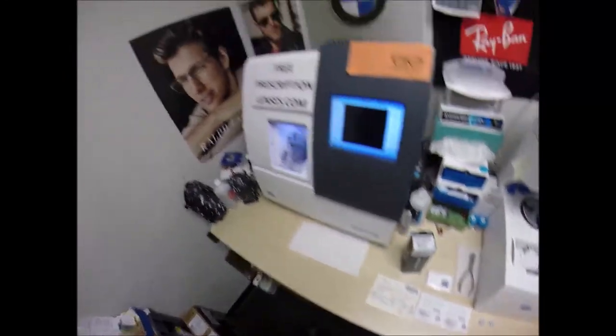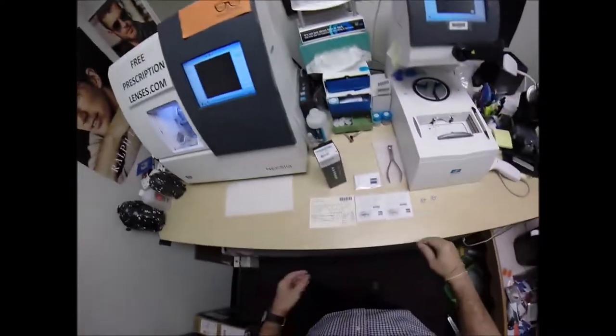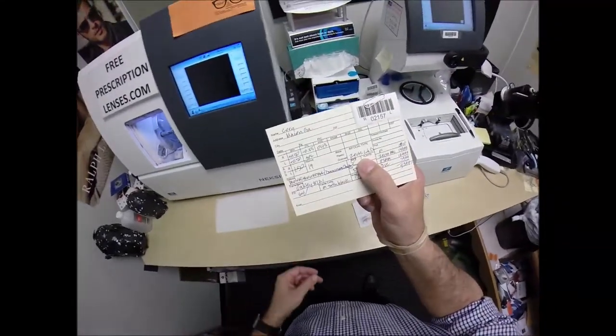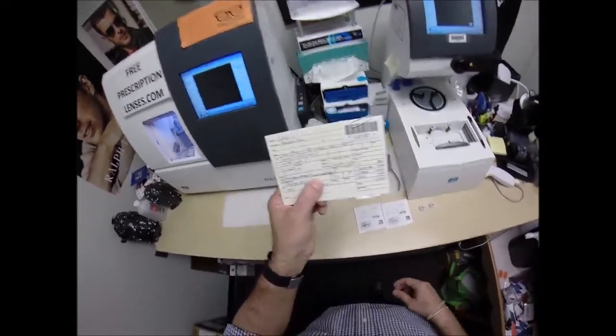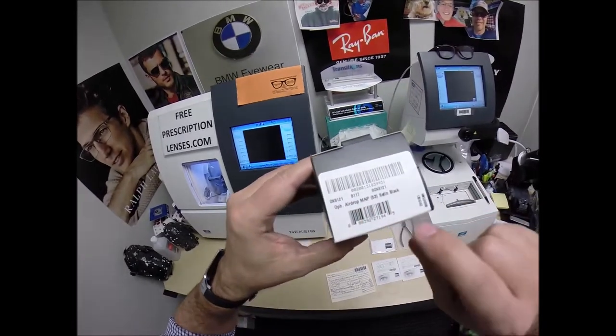Cory in Macon, Georgia. See more better with freeprescriptionlenses.com. Call me Moe, Moe Better, because I'm going to have you seeing Moe better and looking Moe better when I cut the — and I'm going to talk more about this later — the Zeiss Light D Invisible Bifocal with the Photofusion Extra EnduraVision Chrome Anti-Glare for your Oakley 8121.